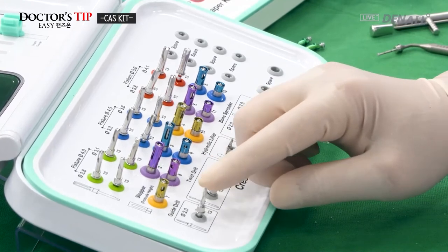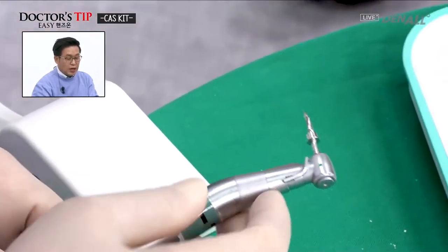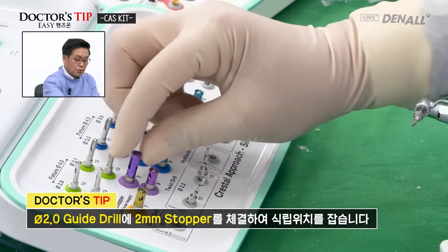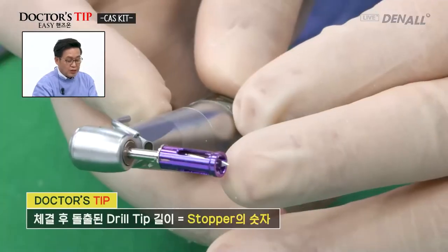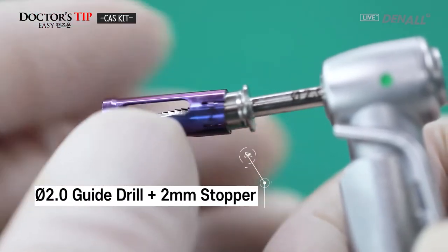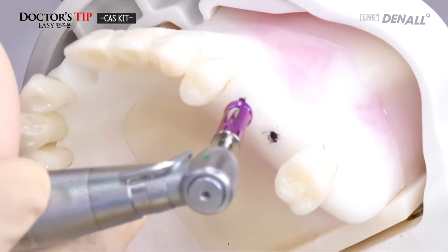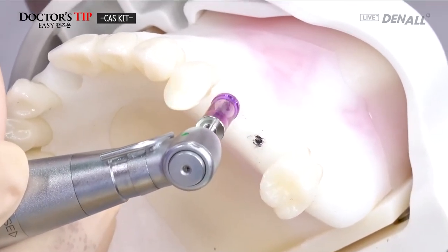The initial drill, guide drill 2.0, is chosen and connected to the handpiece. For the guide drill, we need to check the location. A 2 mm stopper is connected to identify the placement location. Now it is connected. The guide drill tip protrudes a little bit. So it is marked black on the white model. At the 25 location, the marking is to be made.